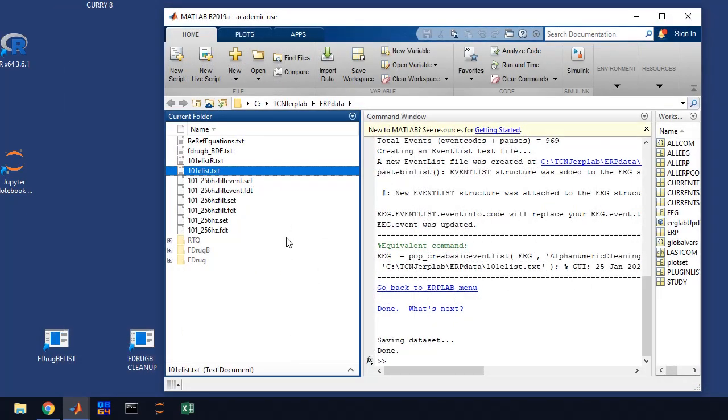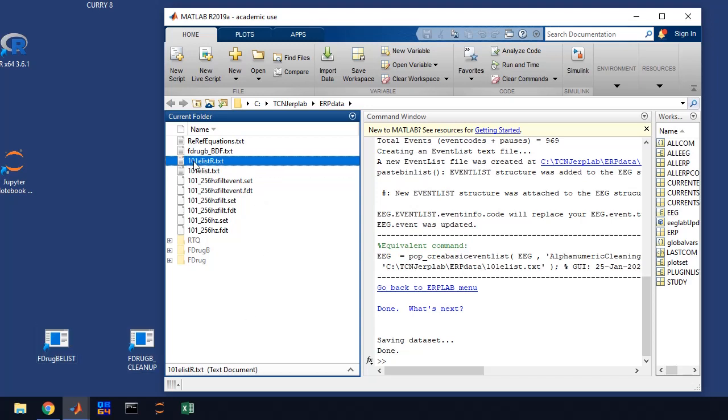So that's fantastic. That's good. In some cases, that's all we need is to create that event list. But in this study, what we're going to do is we're going to recode that event list. We go back in time and we'll recode the study items to identify which ones were subsequently remembered and which ones were subsequently forgotten. So the way to do that is you're going to run this program down here. And you would have in your protocol something similar, a similar program to run. This program, when you type in the subject number, in this case we would type in 101. And we'll open up all of those behavioral data files and figure out what happened on each trial and whether or not that item was later remembered or not remembered and create a new event list. And it'll create this new event list and call it 101 elistr automatically. So I've already done that part of this. You just basically run a program and this file will magically appear.